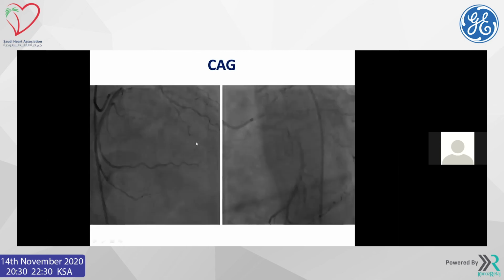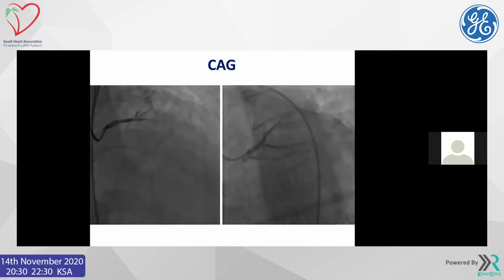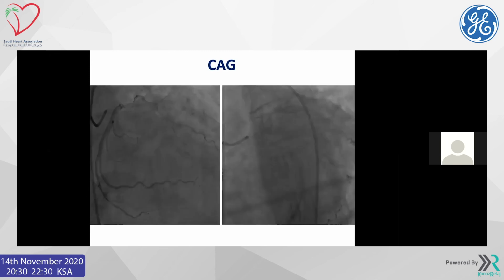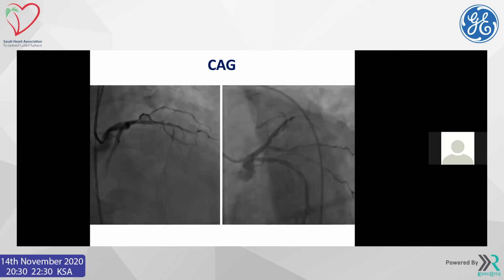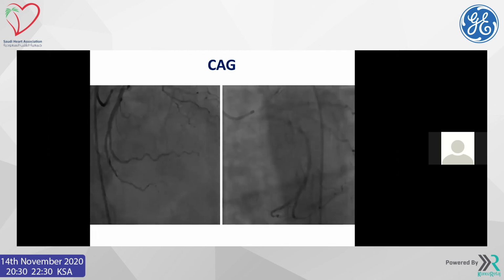And actually, the consensus was not doing any intervention for the coronaries because the right coronary was imaged before and it was small, non-dominant. So all the money is in the LAD and the LAD is non-viable. So to minimize the duration of the intervention, they elected to do nothing for the coronaries.